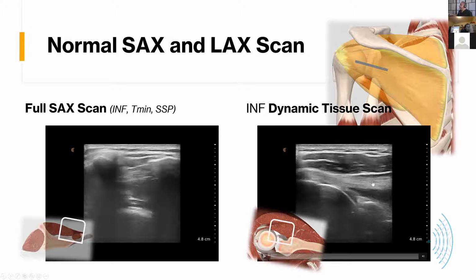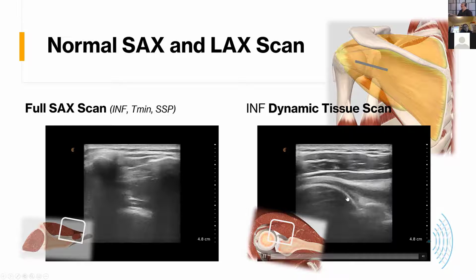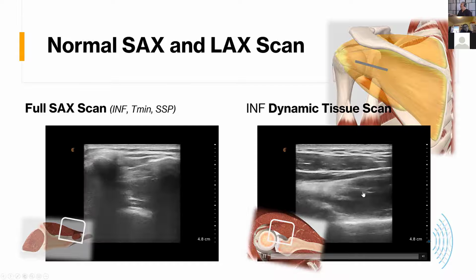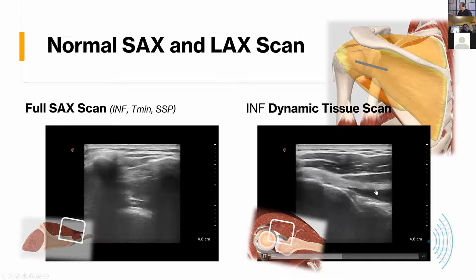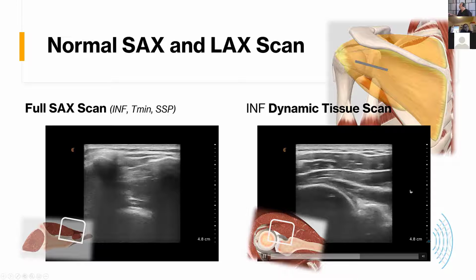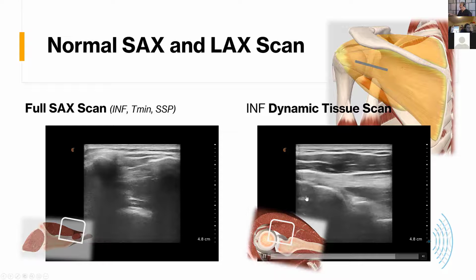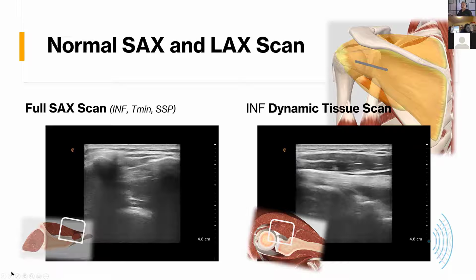That means what we're looking at right here is the long image of the infraspinatus muscle. It is the infraspinatus tendon, above which is the deltoid. So I'm going to hit play on this, and you'll see that the patient is internally and externally rotating their arm. And what you're seeing here is this intramuscular aponeurosis coming in and out of view into its primary tendon insertion on the middle facet of the humerus. We'll move on here to the next one.